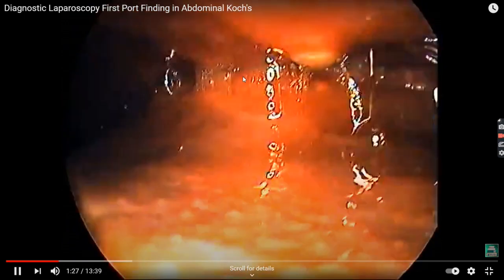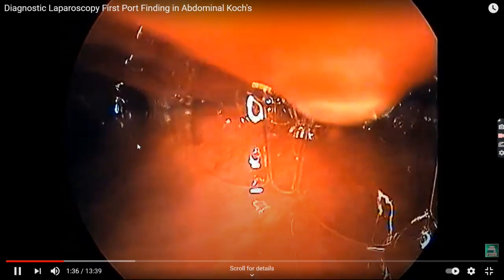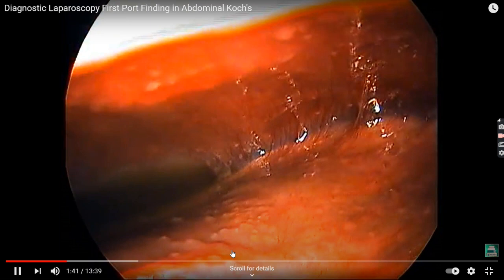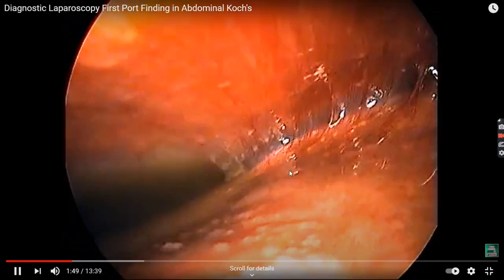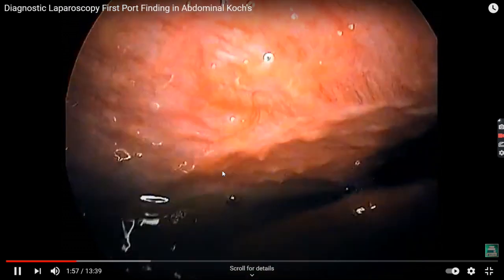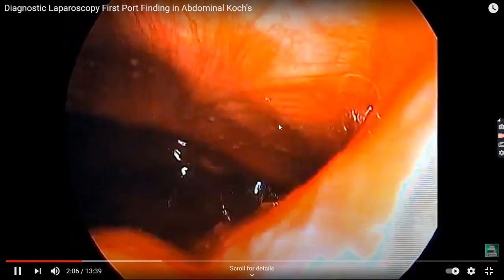There is the granuloma, the white one. Here you can see this one, right? This is the perihepatic adhesions. On the right side, you can see the tubercles over the liver surface also. Here you can see, yes, very clearly visible. Now these are the sites from anywhere from which we can take the biopsy to confirm the diagnosis for tissue diagnosis. You can see the tubercles present over the peritoneal layer also. Here, yes, these are tubercles, very clearly visible.